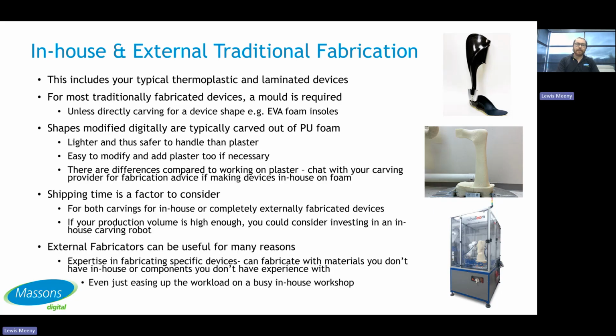External fabricators are very useful, especially when it comes to traditional fab and fabricating with materials or components you don't have experience with. Especially these days with certain funding applications and getting your new shiny and functional components, if you've never used it before, it could be very daunting to pick it up and put it into a device. So you can leverage external fabricators who have that specialized knowledge to do that for you.